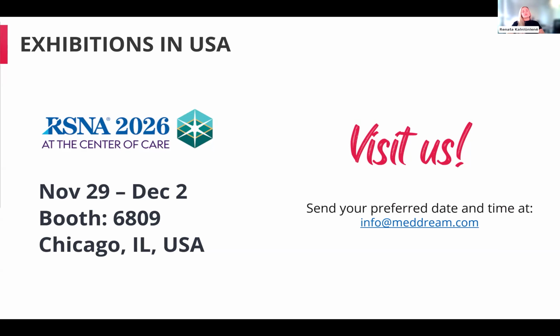And also in September, we are scheduling a webinar for integrations, this time for our partner MedStosorano from Italy, showing their RIS integrated with our other partners, AI for CMR with AI integration. News will be soon.